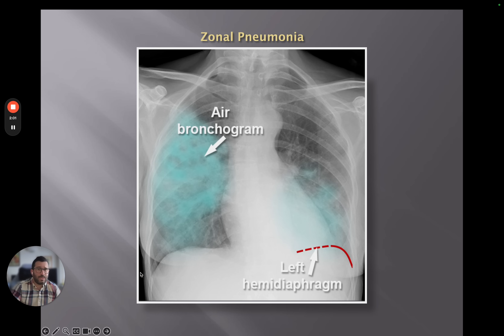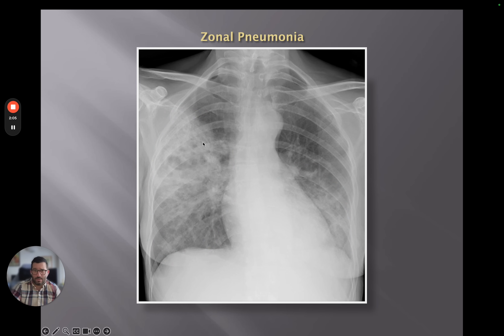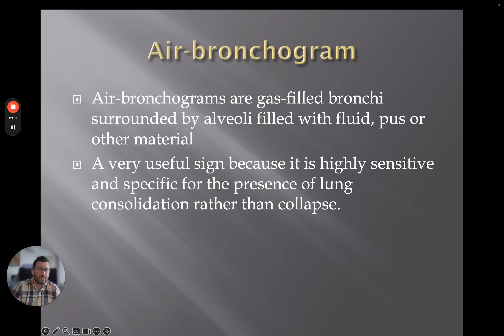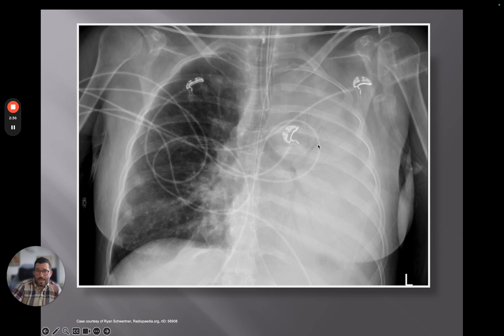Here we can see air bronchograms running through the consolidation — not only do we have the consolidation, but we can see gas-filled bronchi surrounded by the infiltrated alveoli. Whether it be fluid, pus, or other material, this is a very useful sign because it is highly sensitive and specific for the presence of consolidation rather than collapse. We'll describe this as a complete whiteout of the left lung with air bronchograms consistent with consolidation, with some further patchy shadowing throughout the right lung.